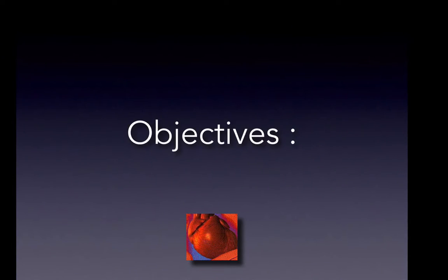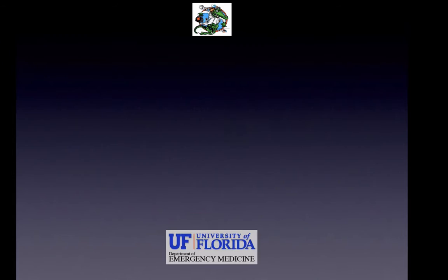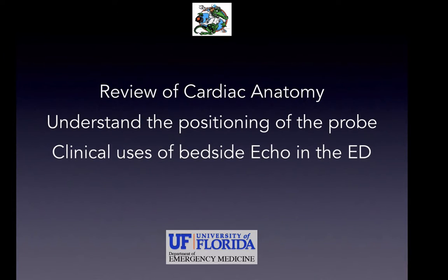The objectives for the cardiac ultrasound are going to be basically a review of cardiac anatomy and understanding of positioning of the probe, and obviously clinical uses of bedside echo in the emergency department.